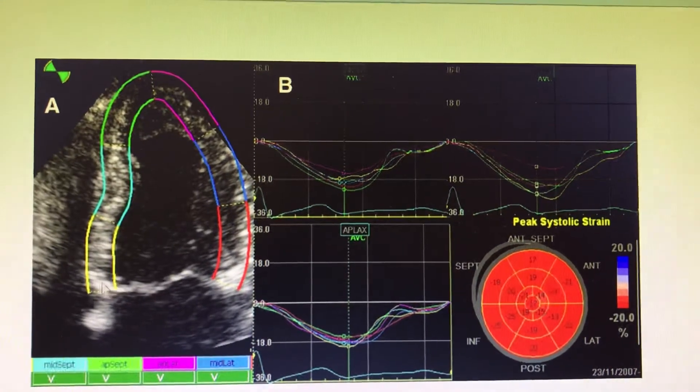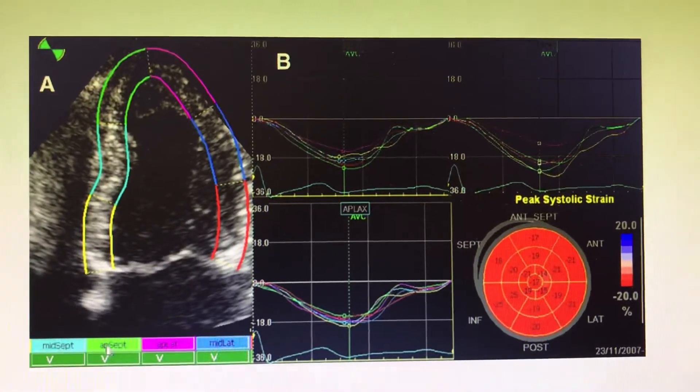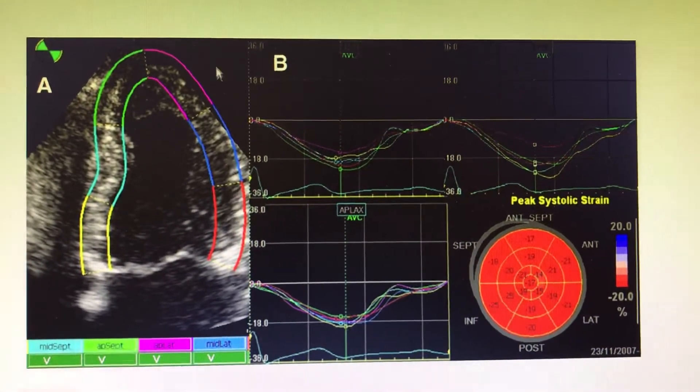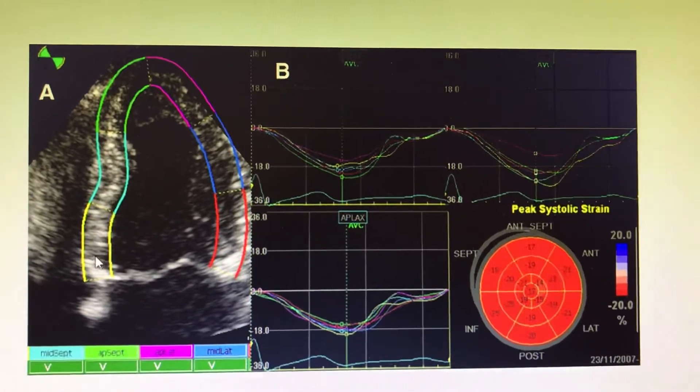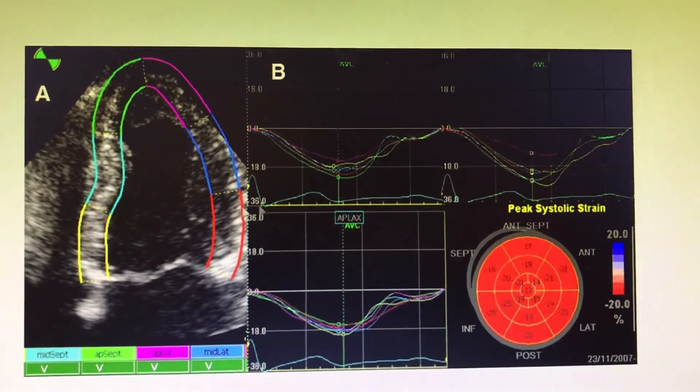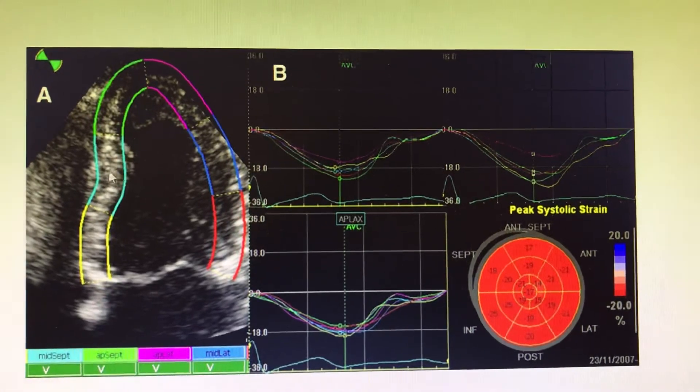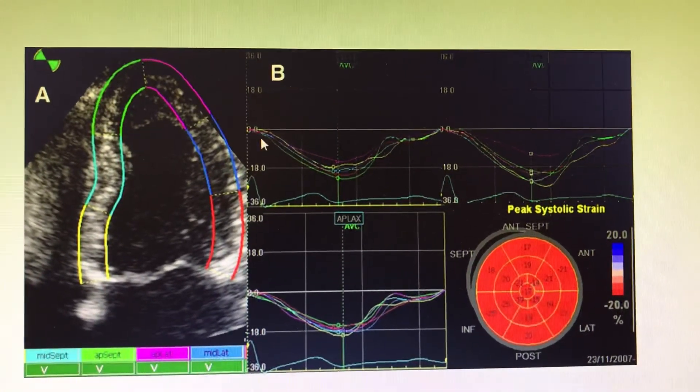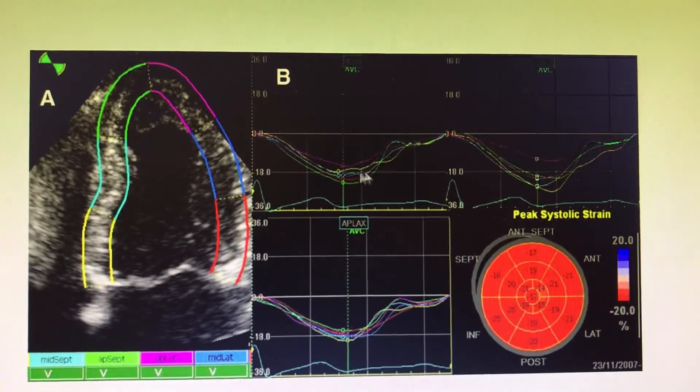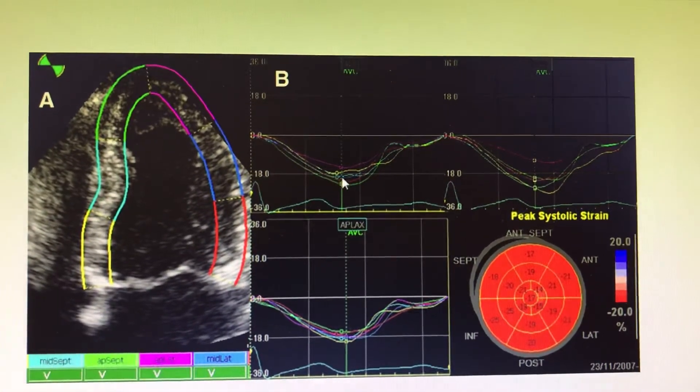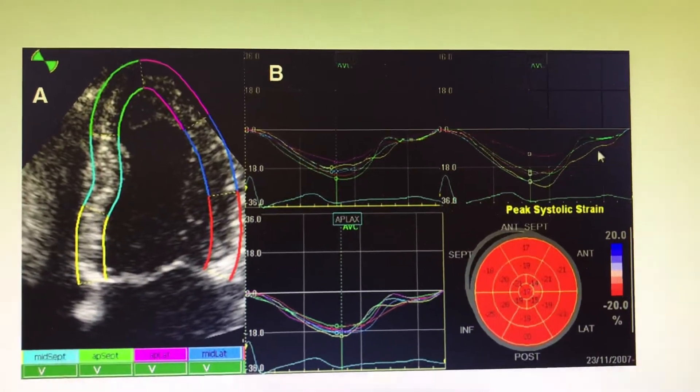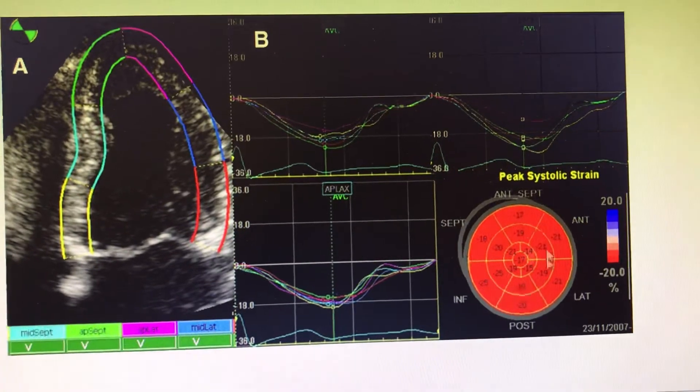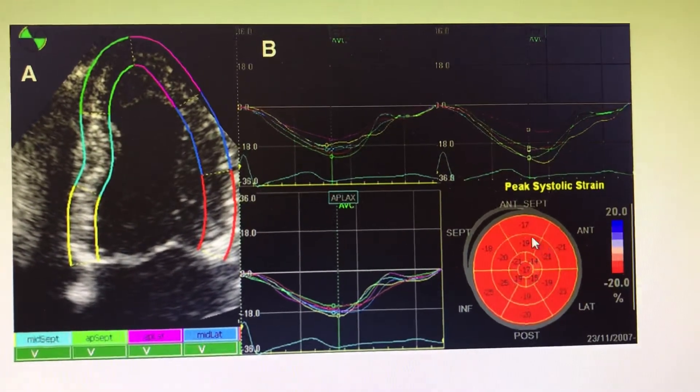You place speckles in separate segments like mid-septal, apical septal, apical lateral, and mid-lateral, giving each a different color code. When you run the software, it measures the speckle movement from one place to another. The contraction of the speckle is tracked over time, similar to M-mode, and the software builds its own region.